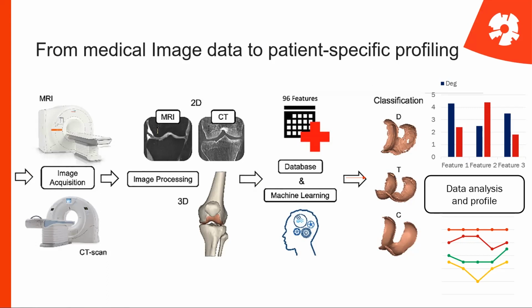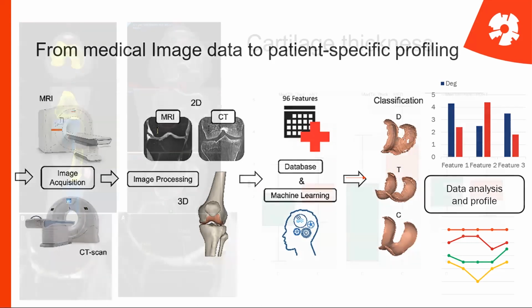These data are available in a European database, Restore. And today we are working on establishing metrics that can be used for a very specific, precise cartilage evaluation.